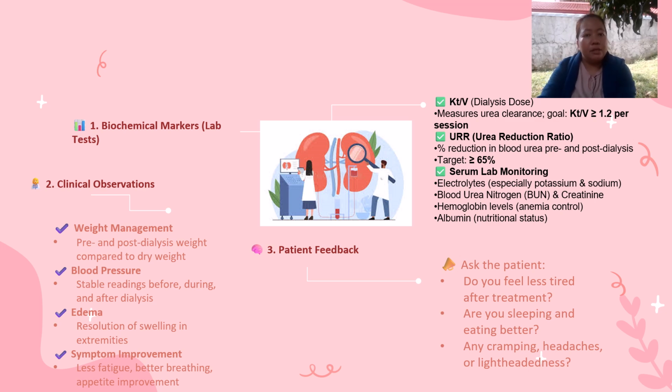Edema: the resolution of swelling in the extremities after dialysis, meaning there's a significant reduction of edema in the face, legs, or even in the abdomen. There's symptom improvement. The patient feels less fatigue, better breathing, and improved appetite. You will also know if the dialysis is sufficient by asking the patient for feedback. Ask the patient, do you feel less tired after treatment? Are you sleeping and eating better? Any cramping, headaches, or lightheadedness?